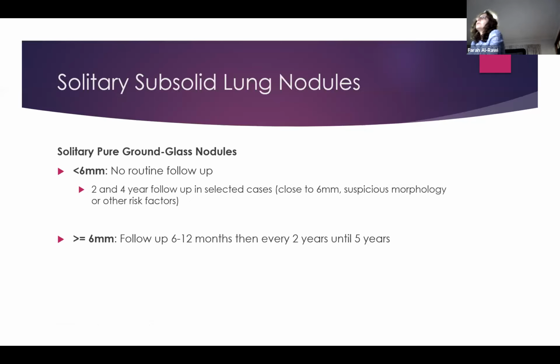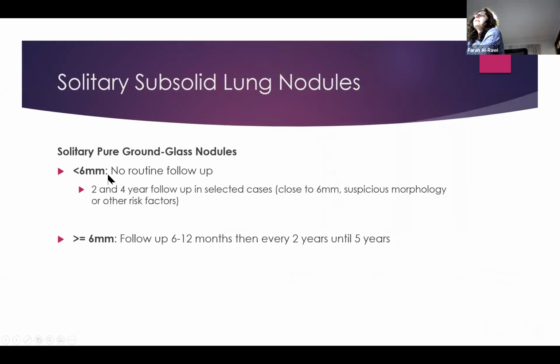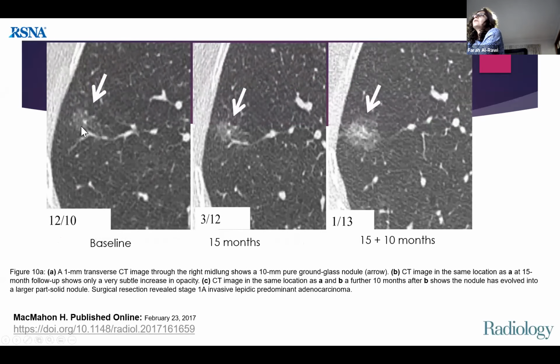Now, a subsolid nodule is also called a ground glass nodule, and I'll just show you the picture to understand what we mean by that. So you can see through it. It's like crushed glass, and that's what we mean by ground glass nodule. It's not as solid as the other ones that I've just shown you. And these we worry about because adenocarcinoma looks like that. And adenocarcinoma is a cancer that's very indolent. It will stay there for a long time, and then suddenly it starts growing. And that's the reason we follow these nodules for many years.